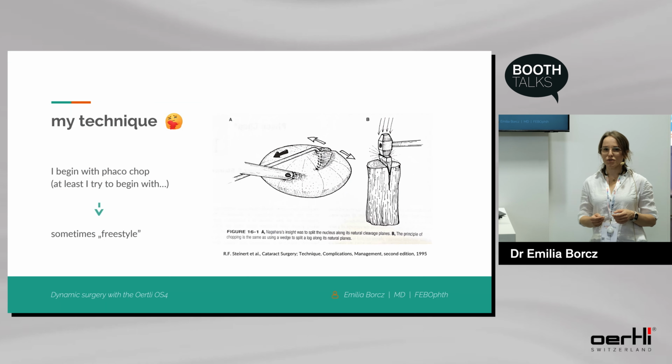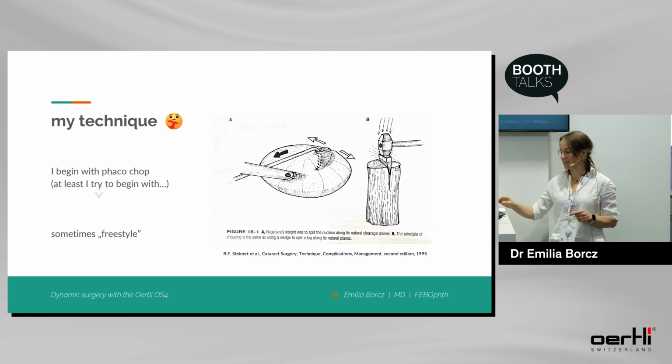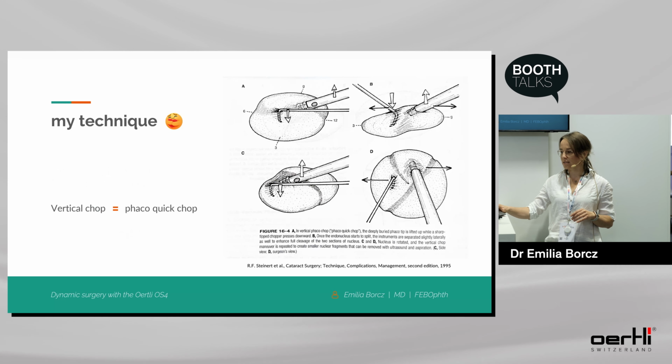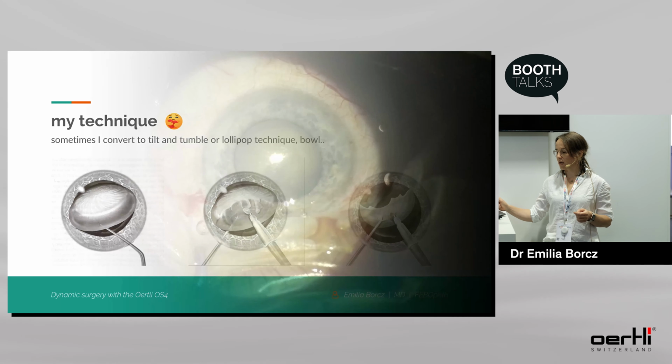I mainly use phaco chop. I begin, or at least I try to begin with this, but sometimes I finish with freestyle, as you will see later. I perform phaco chop vertically or horizontally, depending on the lens. But sometimes I need to convert to tilt and tumble, lollipop, or bowl technique.